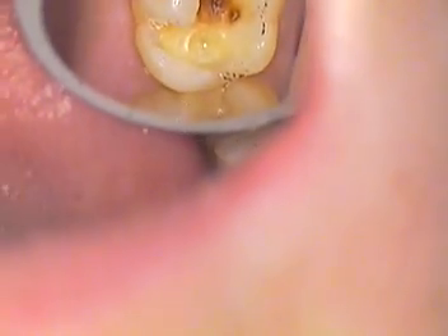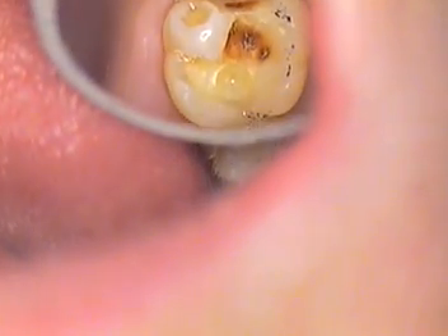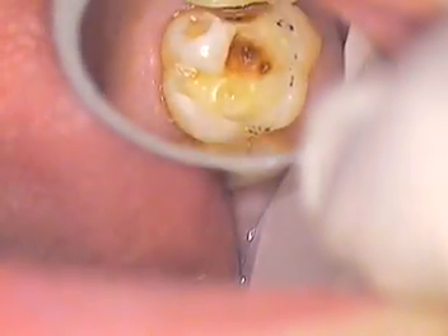This particular procedure today has to do with teeth numbers 2, 3, and 5. As you can see, we're already cleaning out tooth number 3. Tooth 2 had a little repair on the lingual.